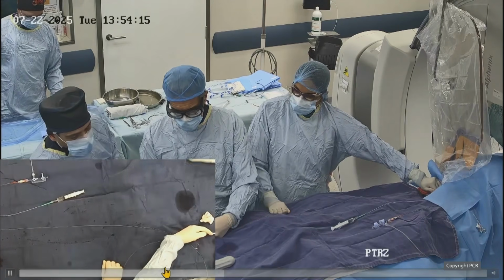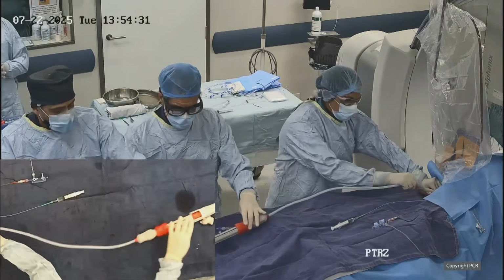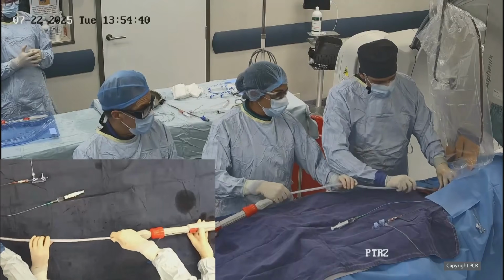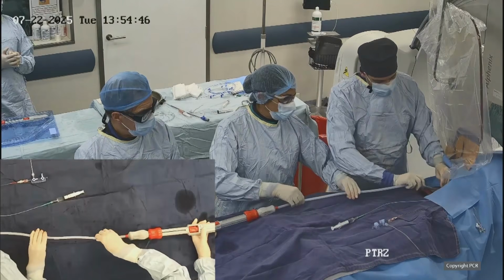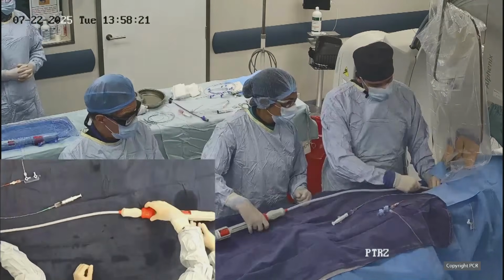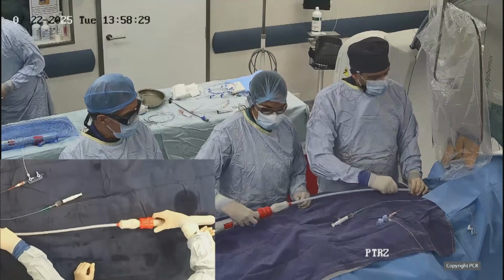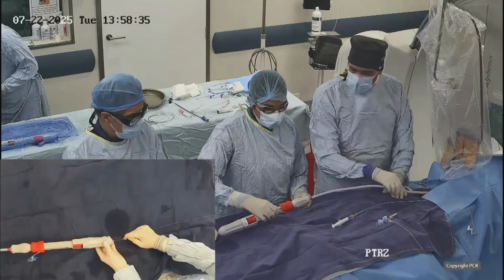And you have a port for the air in the system, and to hydrate, we strongly recommend you to turn the device a little to enter the groin, because it is quite bulky and the transition is not that smooth. So we turn the system, then when we are in the vein, normally everything begins. So we are going to hold the wire.